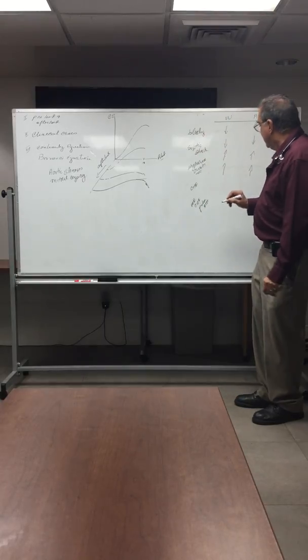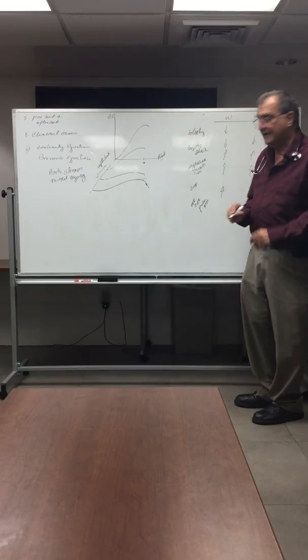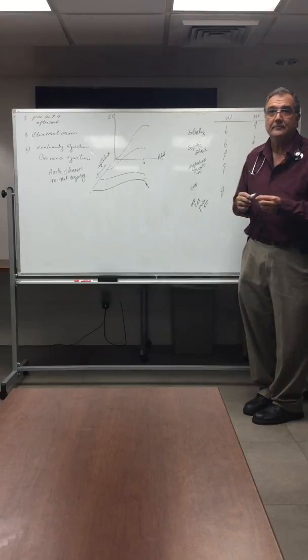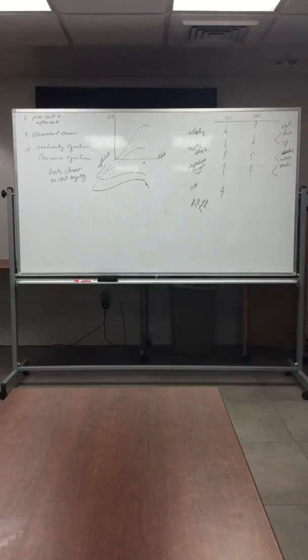Same patient, now this patient comes in with mitral regurg, CHF, but he has pulmonary hypertension. You put in a Swan-Ganz and the wedge is going to be very high, 25. And what do you expect the afterload to be? It's going to be increased also. He's in heart failure. Okay, so the wedge is going to be high too here.